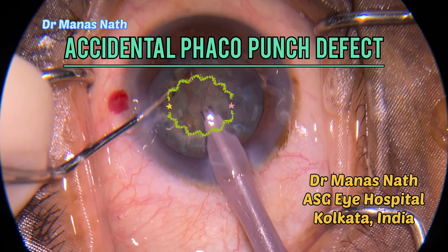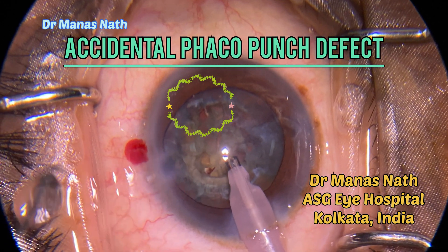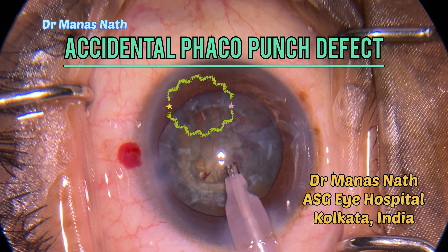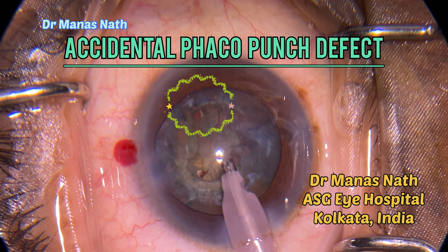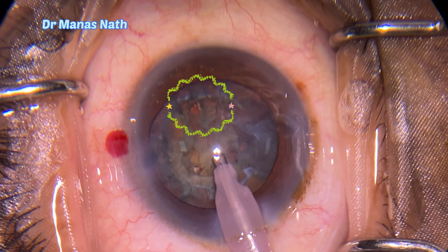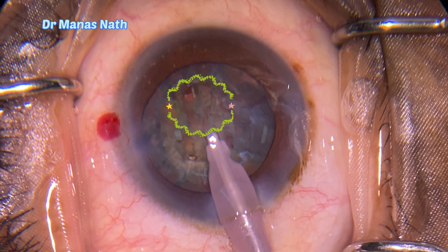Hello everyone. Here you can see that while doing phaco chop, I landed up in an accidental phaco punch defect. I can see the red glow clearly. It was a very difficult situation with the whole nucleus still in the capsular bag. Let's see how I managed this case, and I will also let you know why it happened.